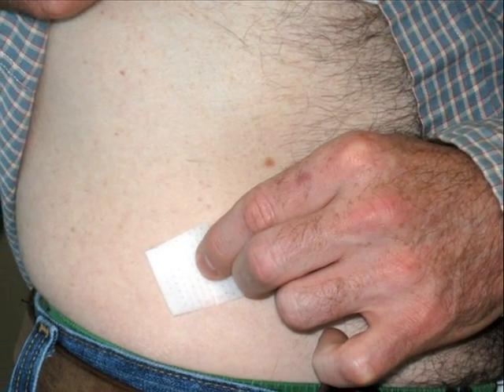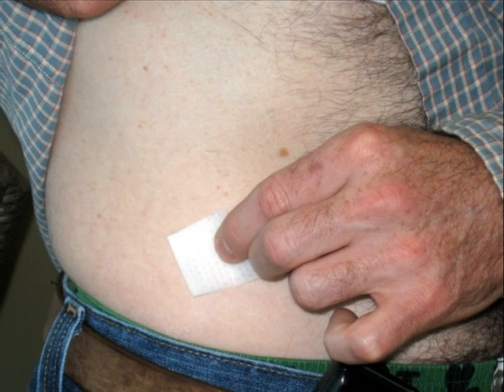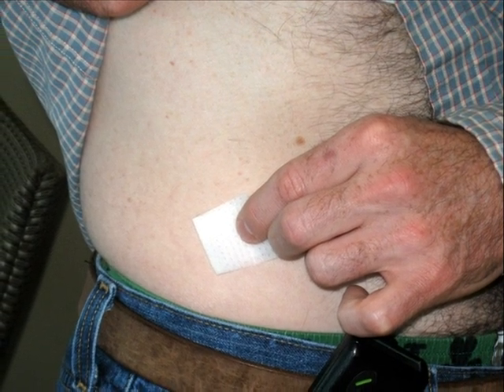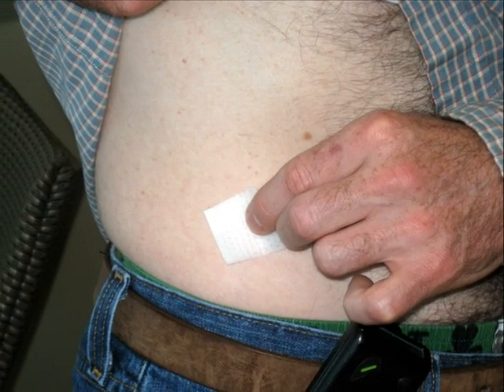If you wish, clean off the injection site with the alcohol swab. If you do this, allow the alcohol to dry before you inject the insulin.